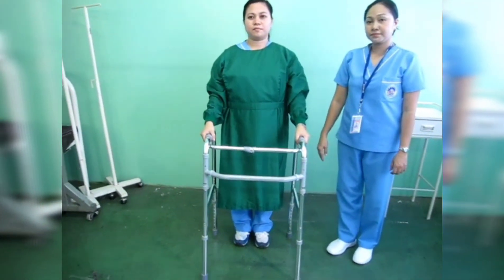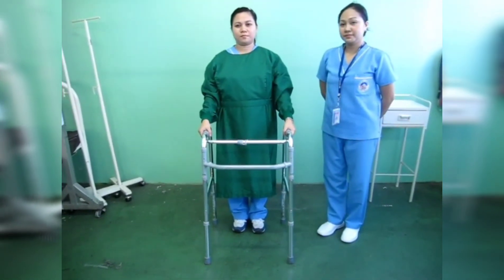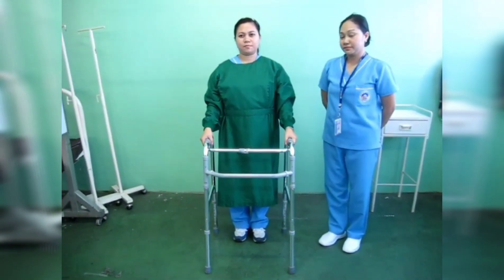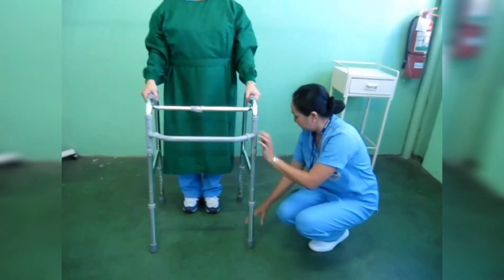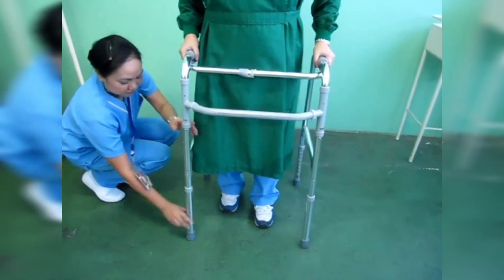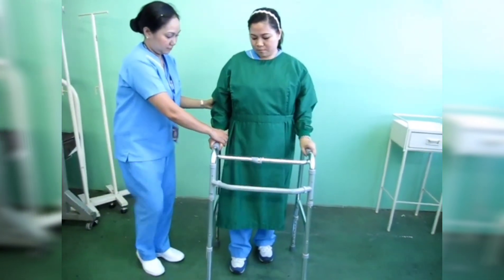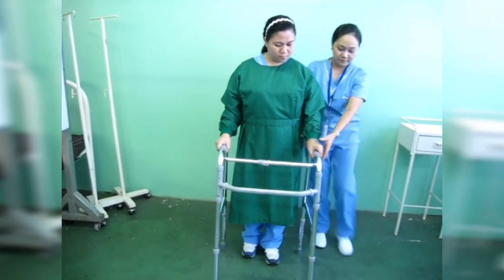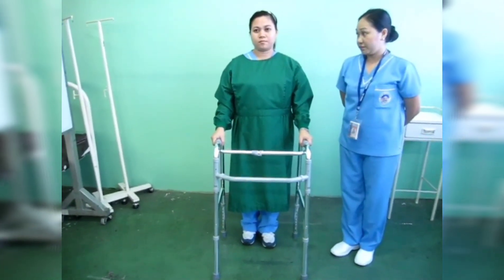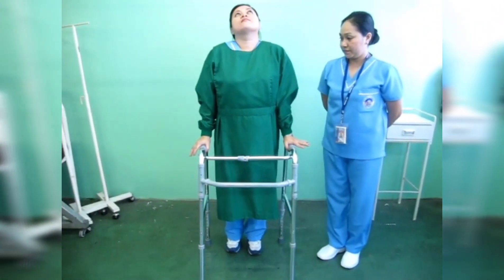Four-wheeled and two-wheeled models of walkers, also known as roller walkers, do not need to be picked up to be moved, but they are less stable than the standard walker. The nurse or caregiver may need to adjust the height of a client's walker so that the hand bar is just below the client's waist and the client's elbows are slightly flexed. This position helps the client assume a more normal stance. A walker that is too low causes the client to stoop; one that is too high makes the client stretch and reach.